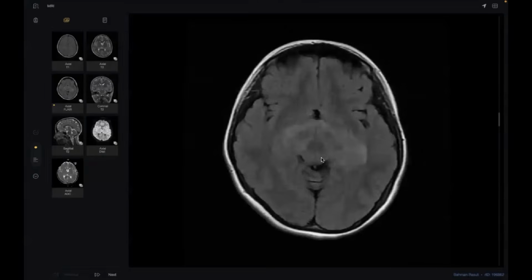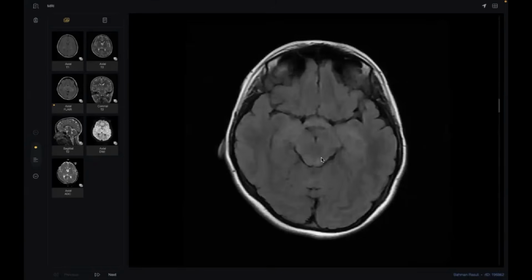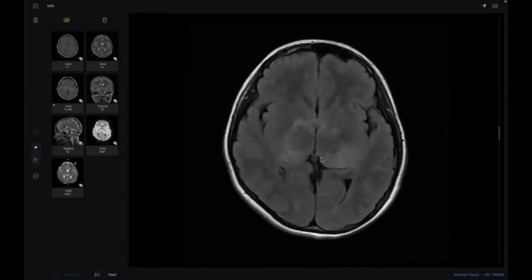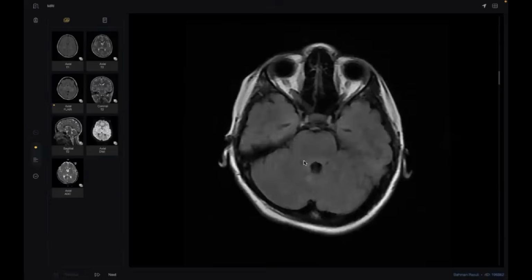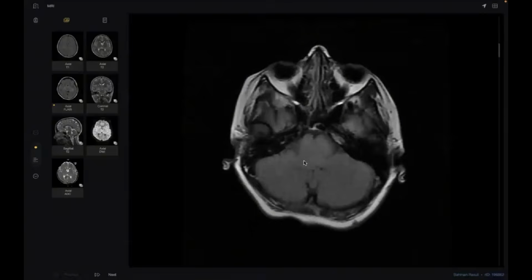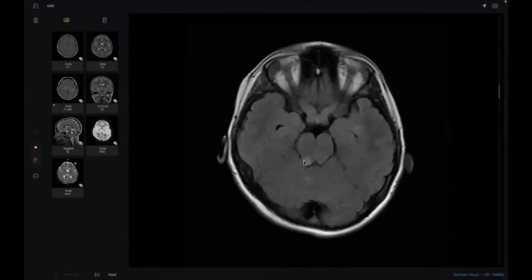You have multiple scattered signal abnormalities, mainly in the basal ganglia and thalami, tectal plate bulging and signal abnormality, bilateral cerebellar hemispheres, and bilateral expansion of the optic chiasm and optic nerve. What does it equal?